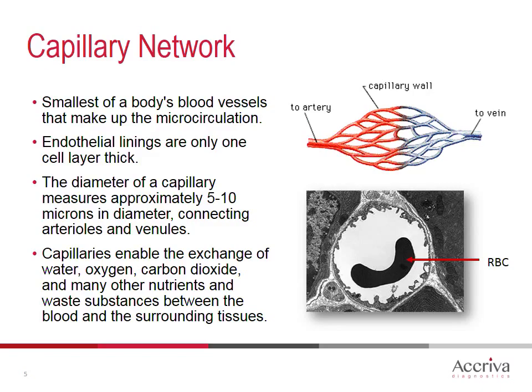On the other hand, it is a reliable measurement to trend PCO2, okay? Now, I know there are non-invasive methods to do the same thing. You know, there are not only pulse oximeters, there are CO2 monitors, end-tidal CO2 monitors, also transcutaneous. But you can use a capillary sample not only for PCO2 measurements, but also for pH. There is very little difference between a venous capillary and arterial pH. And that trending is extremely reliable, and that's well documented in the literature as well.